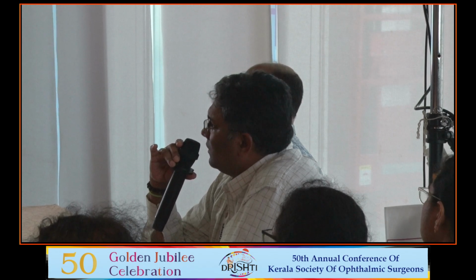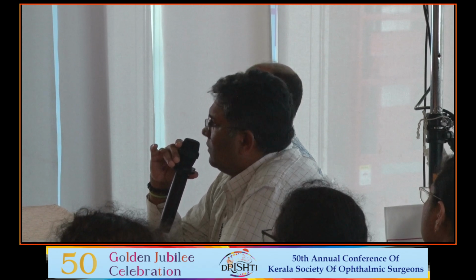In this particular gadget, you have not looked at macular edema, is it? No, sir, we cannot. If it is associated with wide field fluorescein angiogram, then we can assess, but at present it is not.